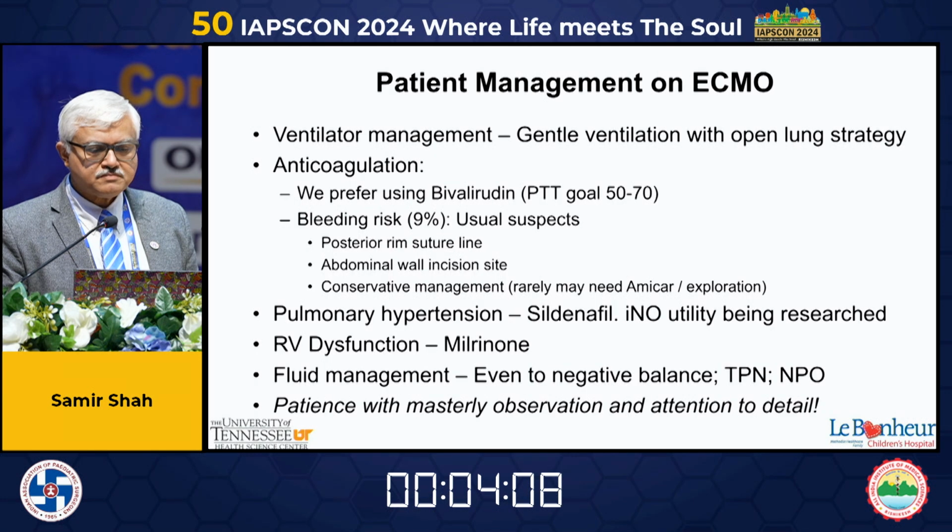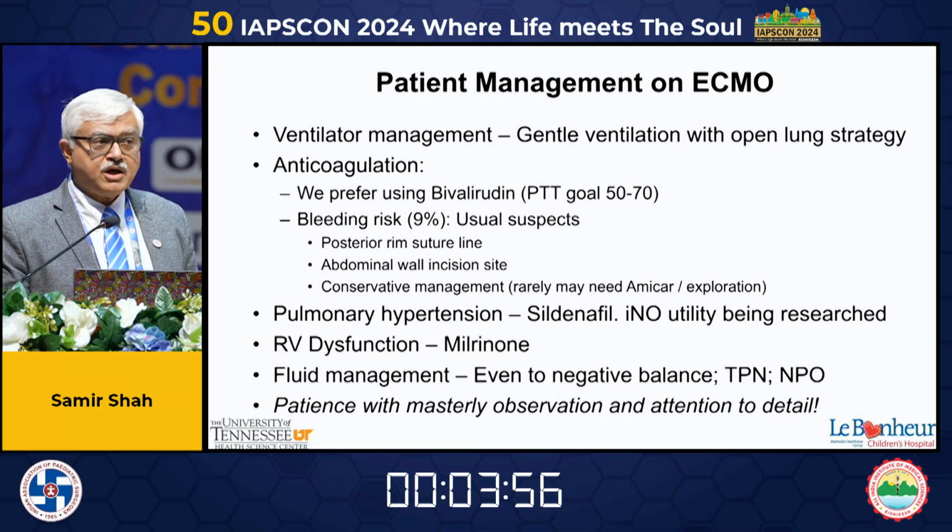This is how the X-ray looks immediately after the repair on day 3 and a patch closure that is done on ECMO. We continue our routine management of these patients on ECMO with gentle ventilation using an open lung strategy. Our anticoagulation is again using bivalirudin. There is a 9% bleeding risk. I'm not going to try and minimize that. That is a risk that we have to undertake when you have a patient that's on ECMO. But most of the bleeding can be managed conservatively.